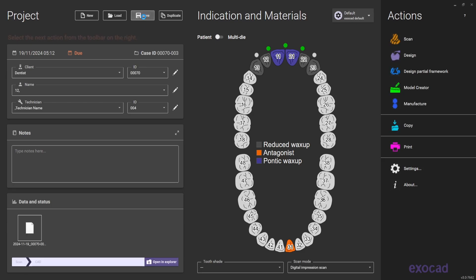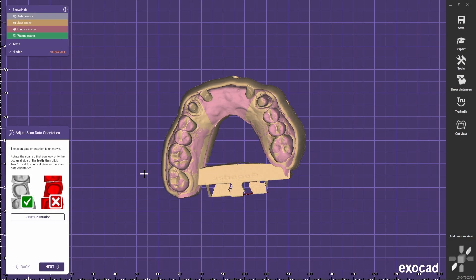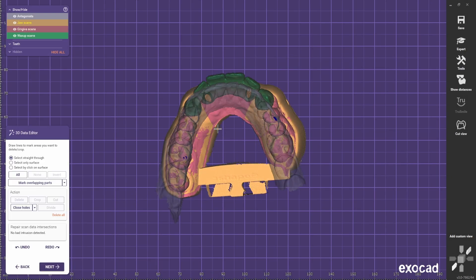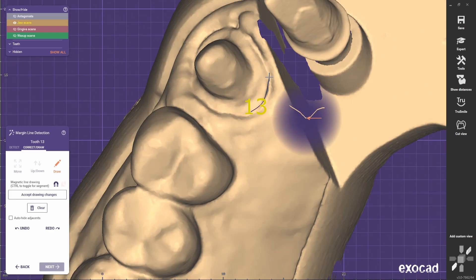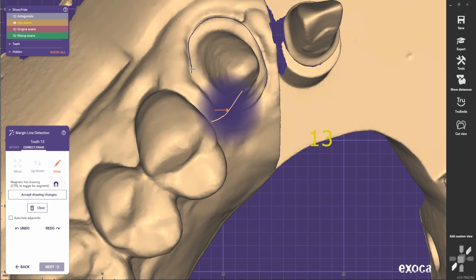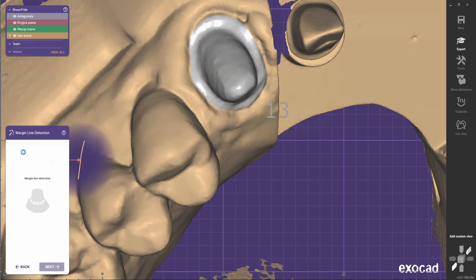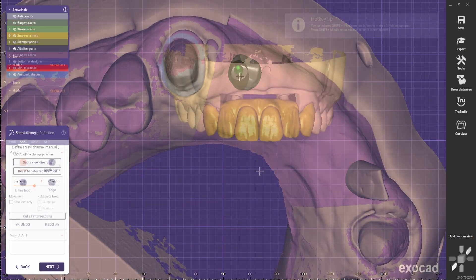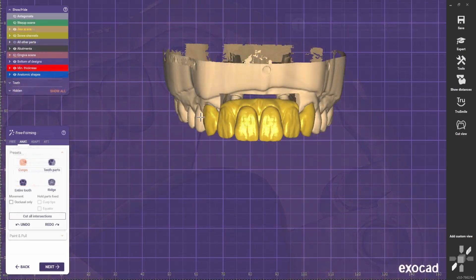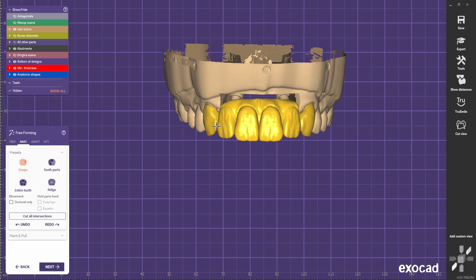Save the project and start designing. After bringing up the models, set up the margins. After setting up the margins, we have the wax-up adapted to the margins now.